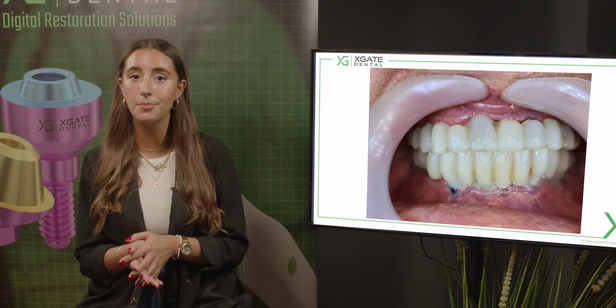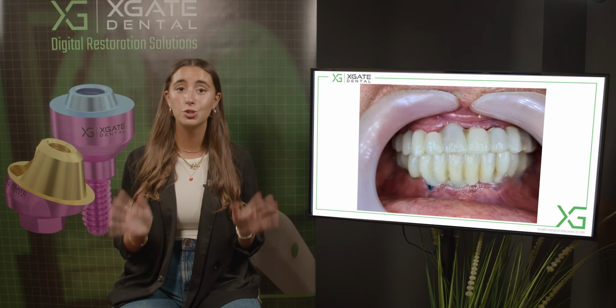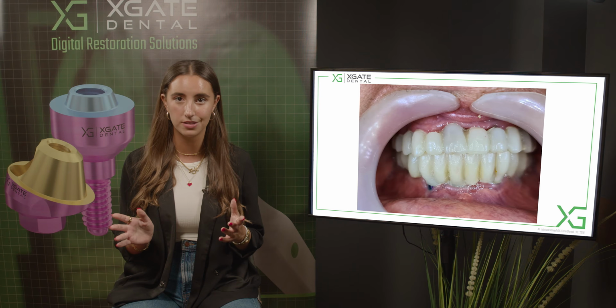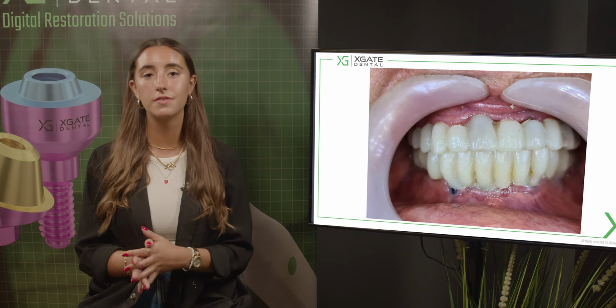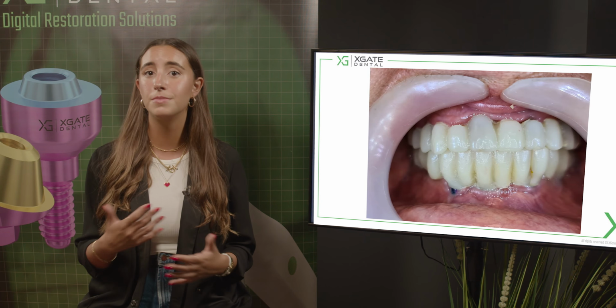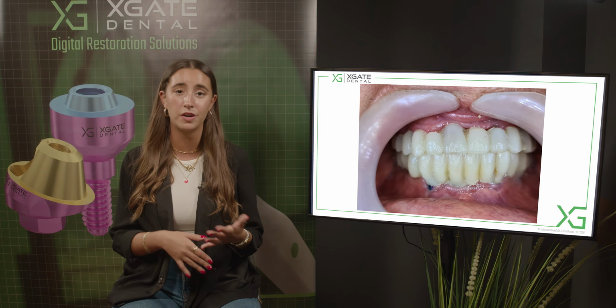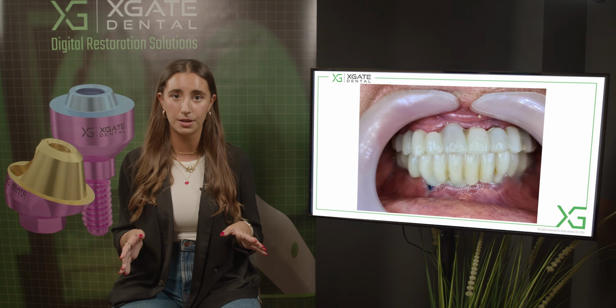You can't have one temporary bridge and in this one temporary bridge get everything perfect and go straight to the zirconia. It's unrealistic. It's a process, and a lot of times things can happen that you can't anticipate, and you could have some misalignment in the impression taking process because of the blood, the clots, the gingiva. Anything can interfere with the scanning process.